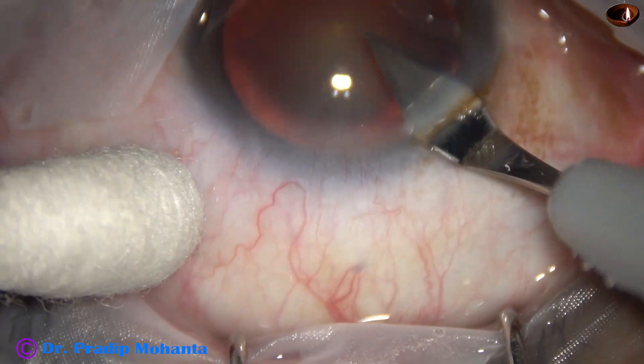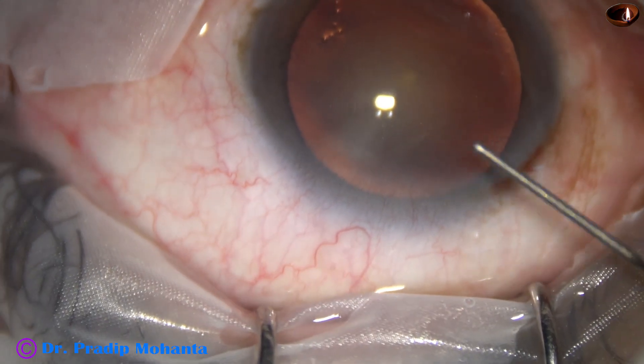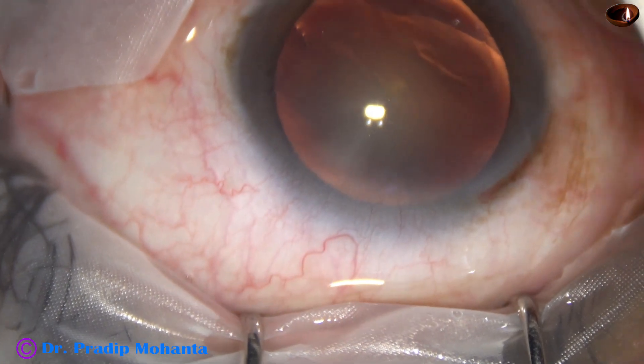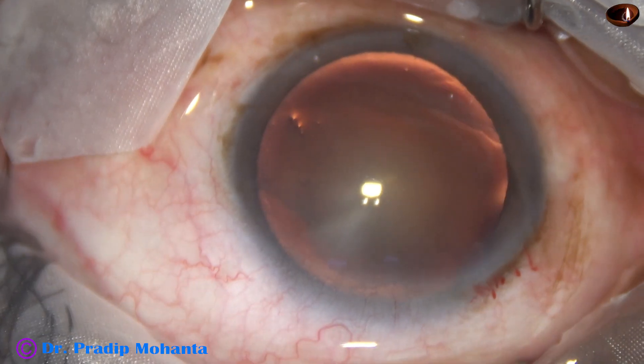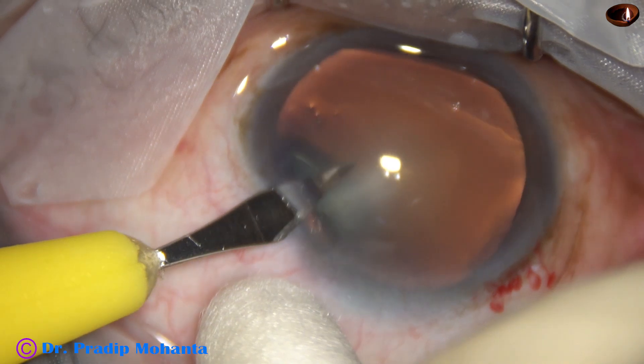This is the ideal case for pre-chop because if we try to hold the nuclear mass in such cases with vacuum, the matter in front gets eaten up. We cannot hold the matter. In such cases, pre-chop is the ideal technique.